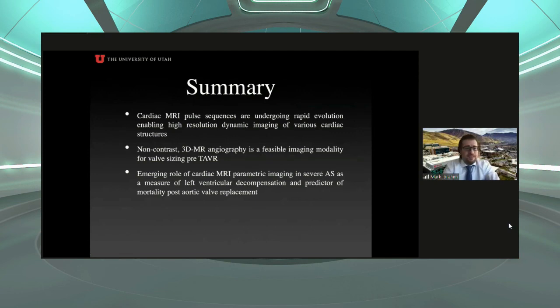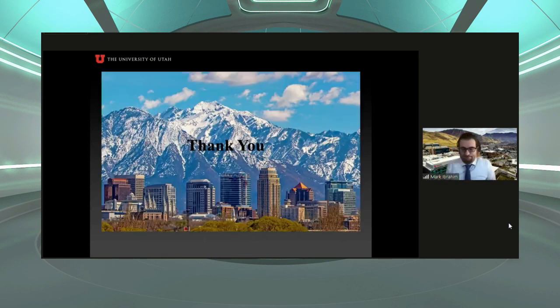Okay, here's my summary. Basically, 3D MR angiography is a feasible imaging modality for valve sizing before TAVR, and there is an emerging role for cardiac MRI parametric imaging in severe AS as a measure of LV decompensation and predictor of outcome.